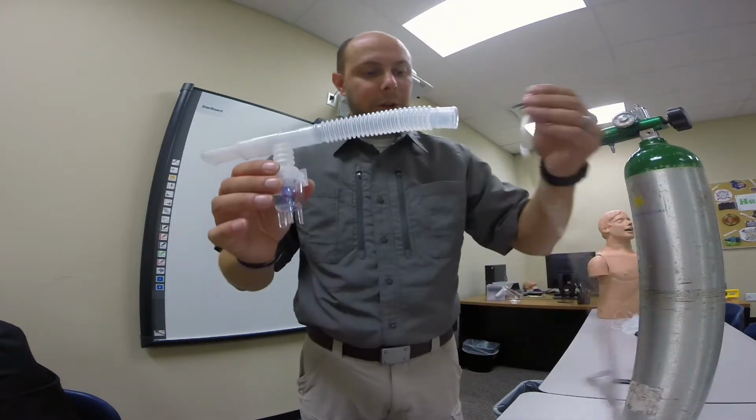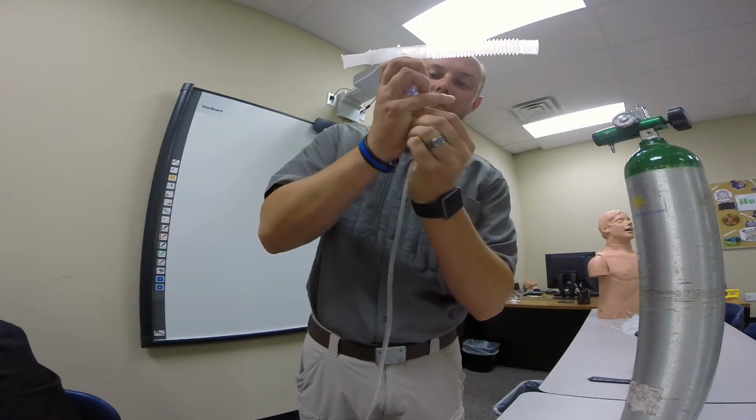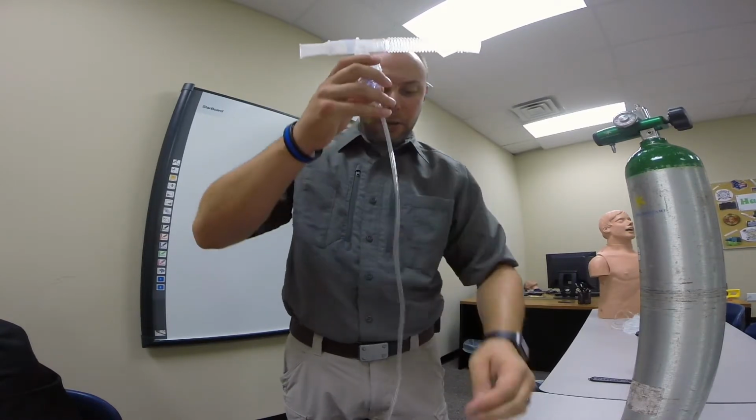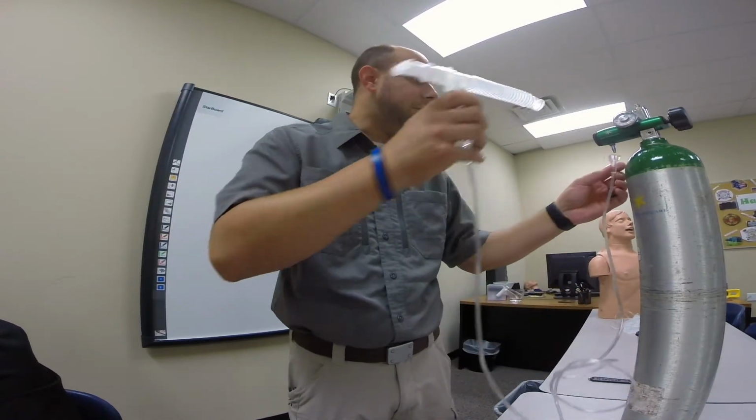So now we'll hook up our oxygen tubing. Plugs right into the bottom. And then the other end is going to go into the oxygen canister.